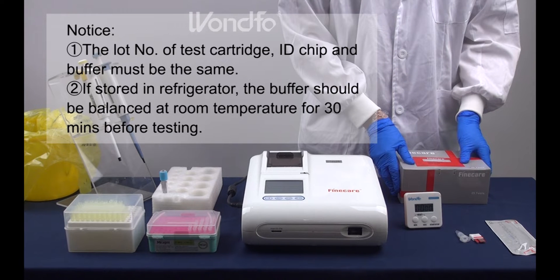Notice: number 1, the lot number of the test cartridge, ID chip and buffer must be the same. Number 2, if stored in the refrigerator, the buffer should be balanced at room temperature for 30 minutes before testing.